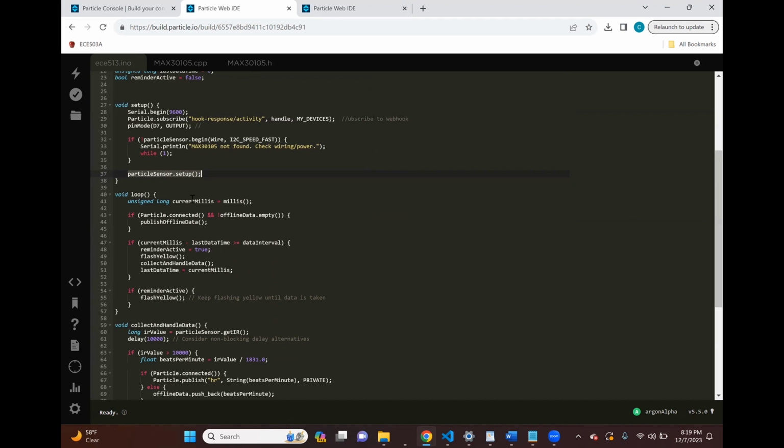Then here in the loop, we start with timing. First, we check if the Particle is connected and if the offline data structure is empty. If it's not empty, we publish the offline data by calling this publish offline data function, which will be explained further below.